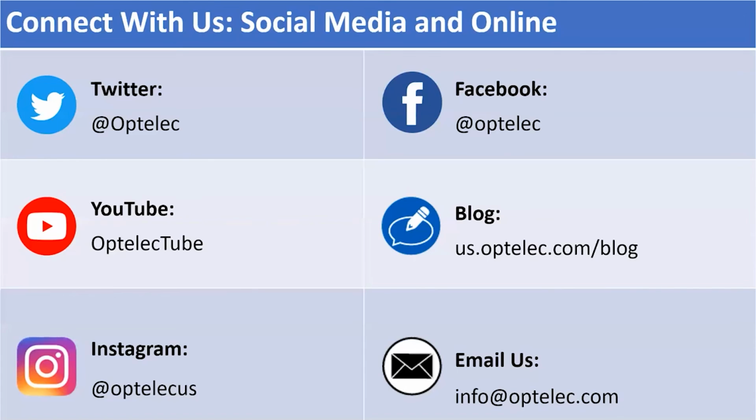And so you've seen Optelec move into a much more portable approach. They've got a ClearView Go now, which is a true desktop that actually folds, and provides a step up, if you like, from the Compact 10, has distance and whatnot.